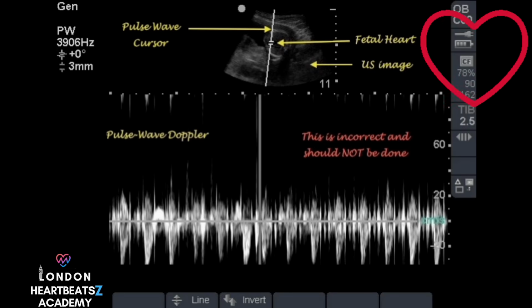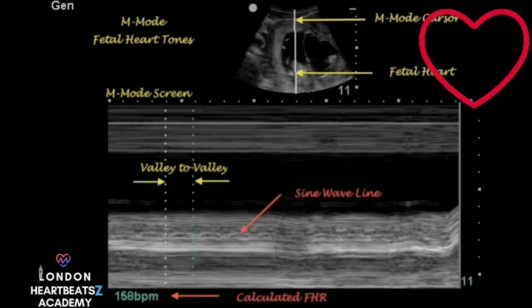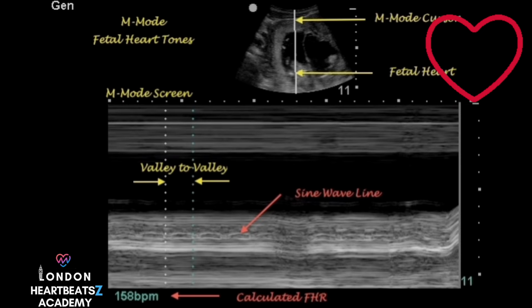And it makes perfect sense. You're not just seeing the structure, the anatomy, but also checking how the blood is actually flowing through it, the function. Exactly. It adds a crucial functional layer to the anatomical assessment.